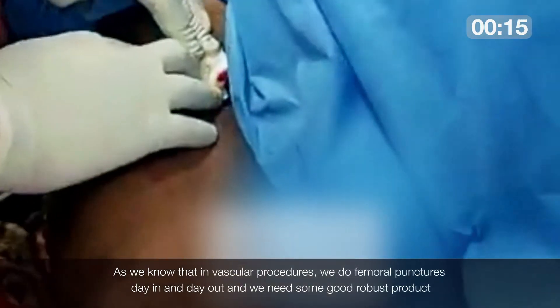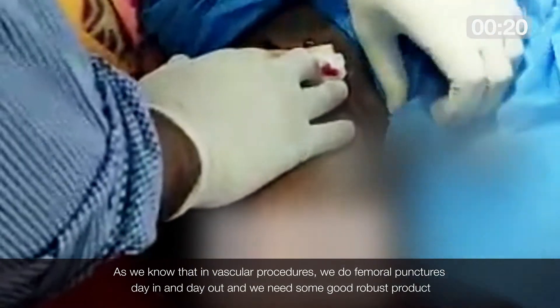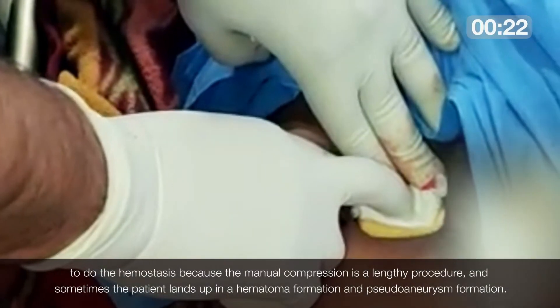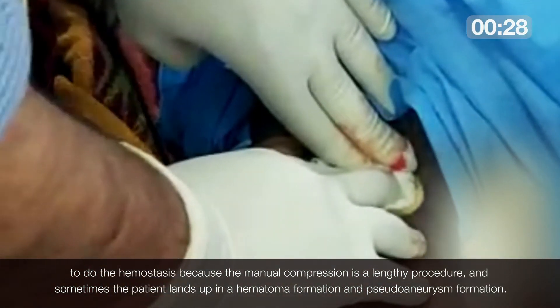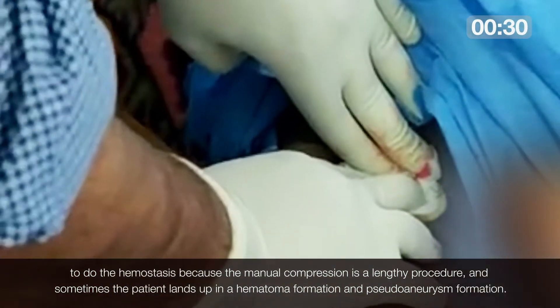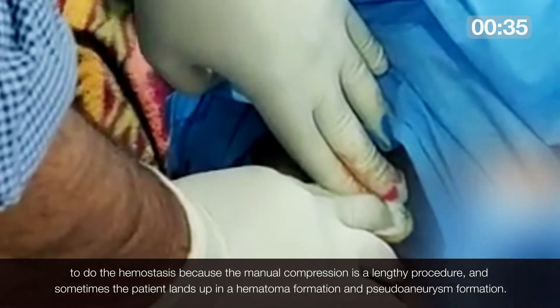As we know, in vascular procedures we do femoral punctures day in and day out, and we need a good robust product for hemostasis, because manual compression is a lengthy procedure and sometimes the patient ends up with hematoma formation and pseudoaneurysm formation.